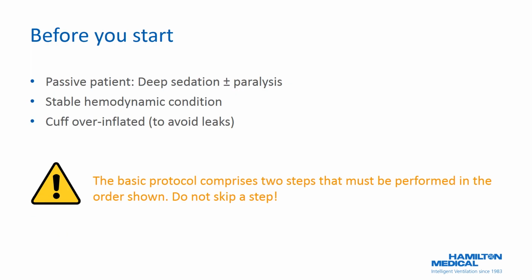Most patients require deep sedation, with some patients requiring an additional neuromuscular blockade to prevent spontaneous breathing efforts. Monitoring the patient's hemodynamics during both maneuvers, the diagnostic and recruitment, is crucial. In the event of any hemodynamic impairment, stop the maneuver immediately. Ensure the ET tube cuff is inflated to a pressure higher than the maximum pressure specified in the PV Tool settings. If used, the IntelliCuff pressure controller automatically adjusts the cuff pressure accordingly.